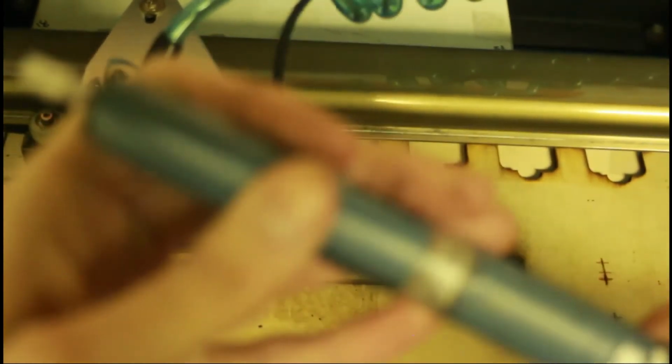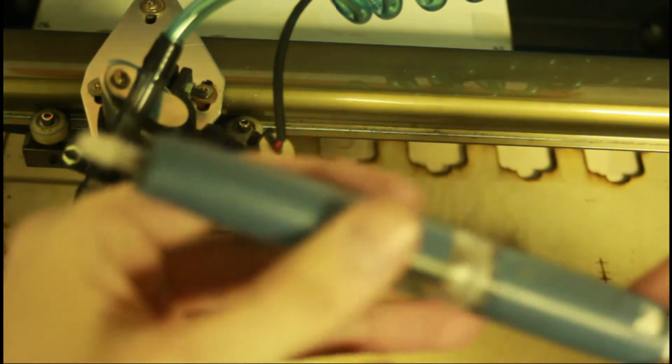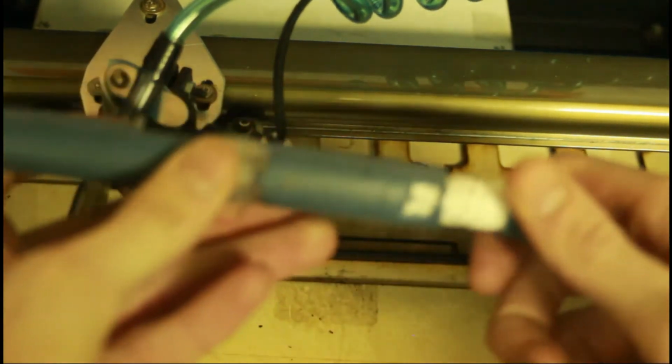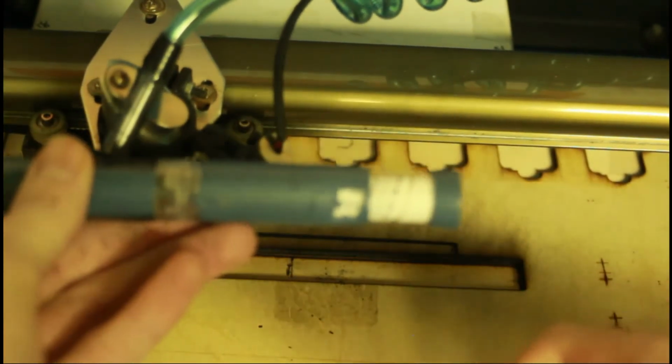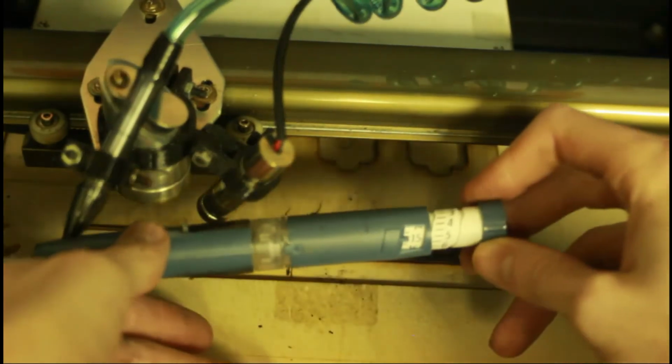Let's bring it down to 3. All right, now it's at just about 3 units. Let's see what happens if we use, let's say, 15 on this. All right, so I got it dialed up to 15. I know it's a little blurry, but believe me, it definitely says 15.